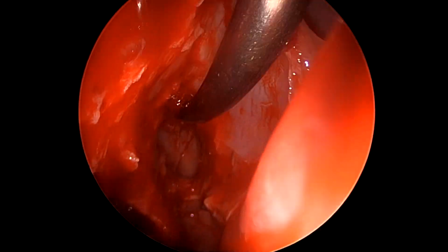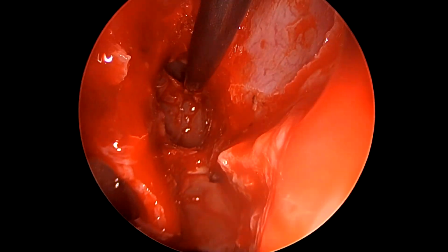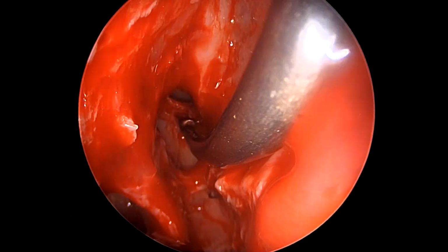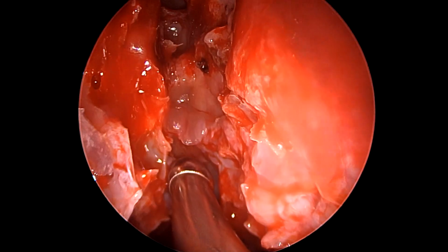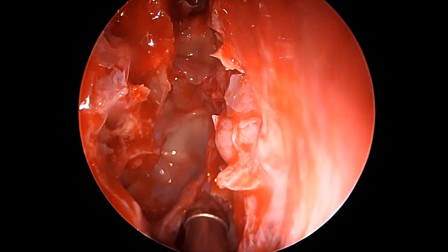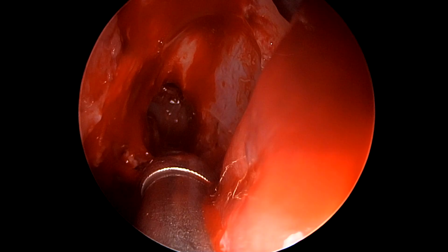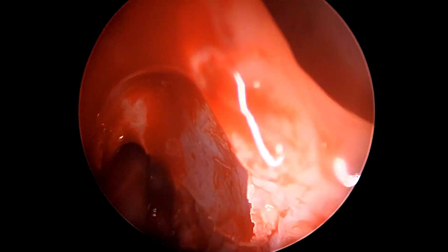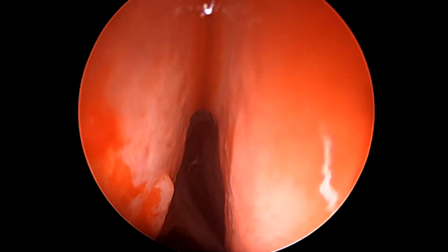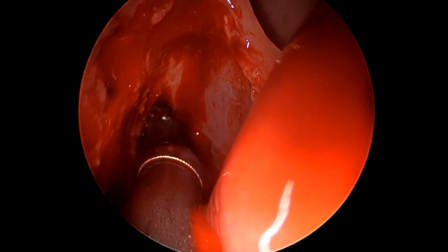But since it's a very high cell, at the height of 50% of the frontal sinus, trying to go behind that cell with the back of the frontal curette is rather awkward to be able to gain access. But eventually what we have seen is that we have opened the frontal sinus proper and opened these T3 cells as well on the right side.